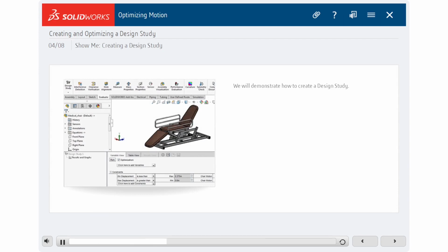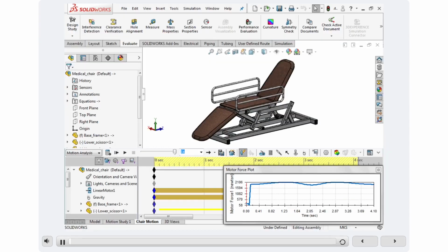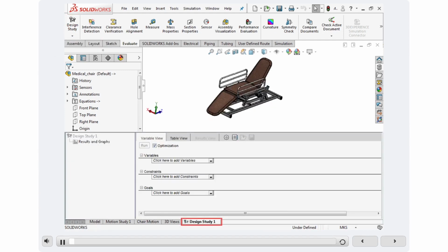Let's see how to create a design study. Click Show Me to launch a demonstration video. Now we will create a design study. Click Design Study. Rename the study to Chair Optimization. The Design Study interface opens up at the bottom of the screen. It offers two view styles, a variable view where parameters can be entered in a variable form, and a table view where a discrete set of values for each variable can be shown.